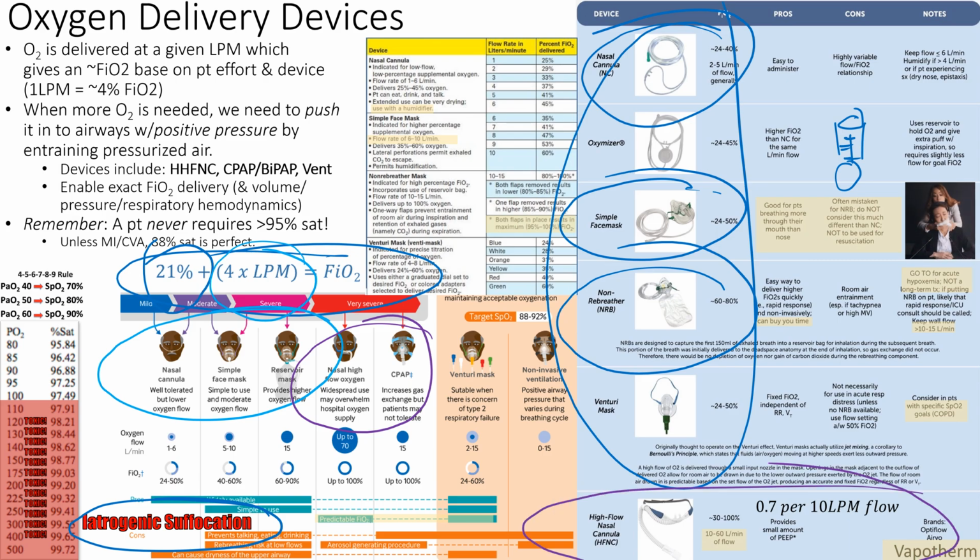It's also called a heated high-flow nasal cannula insufflation device, right? Or Vapotherm, if you want to support the big market. That's the brand name, because there's another brand name called OptiFlow, which is another company that produces these devices. There's also another one out there that looks like a hood that goes over the patient's head, like a little spaceman, and that actually provides that little positive pressure ventilation.